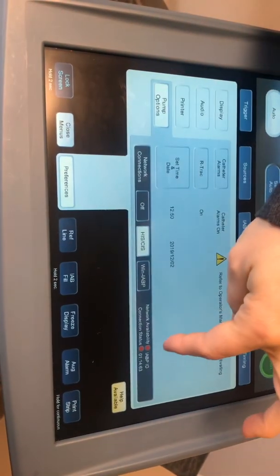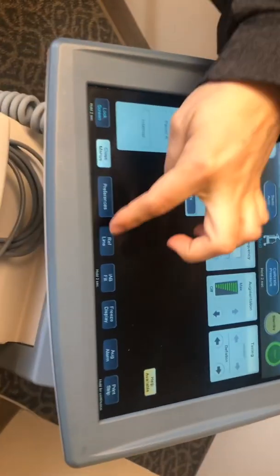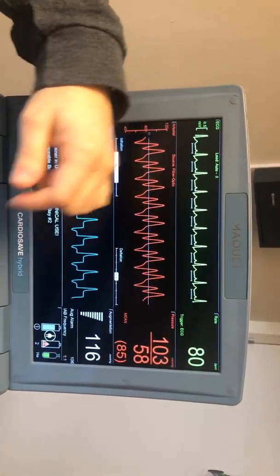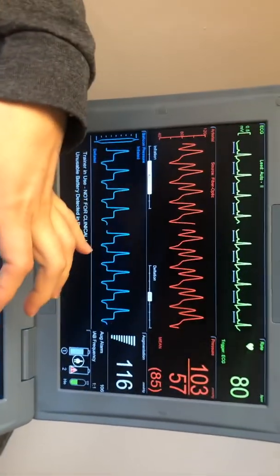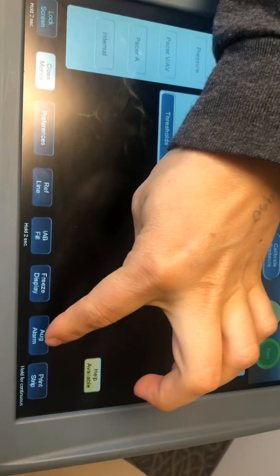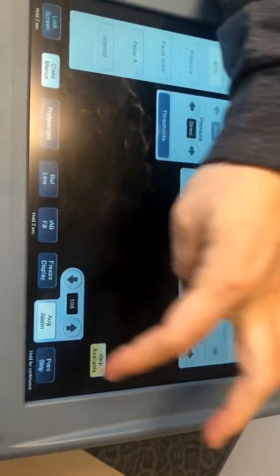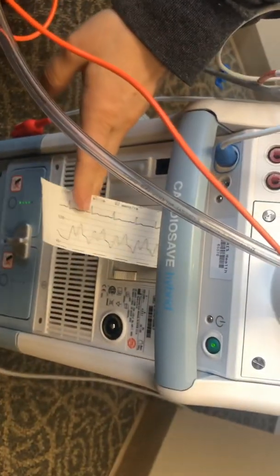You can go to pump options, and when you need to plug in your ethernet cable, go to network connections, hit HIS CIS, and when it's plugged in and the network is connected you'll get two green dots over here. You can also hit the reference line if you need to look at your waveform, and do freeze display if you want to check the timing while your balloon pump is still going. You can unfreeze your augmentation alarm if you need to adjust that, and if you need to print a strip right away you can print here — it's going to print up here in the front rather than on the side like the other one.